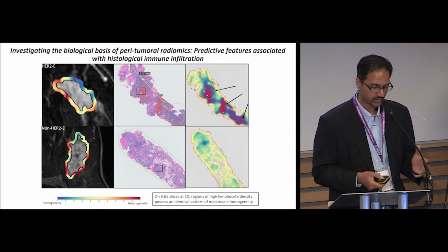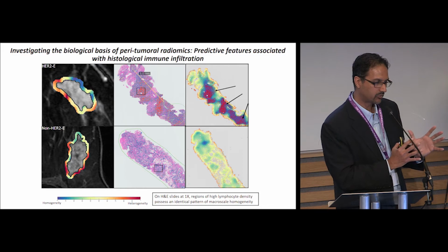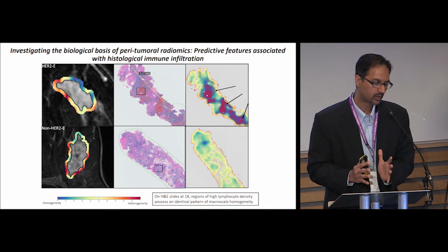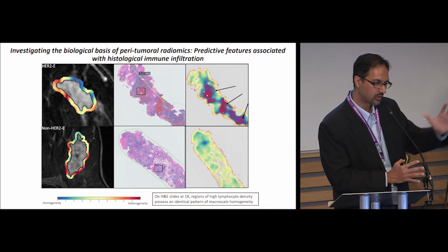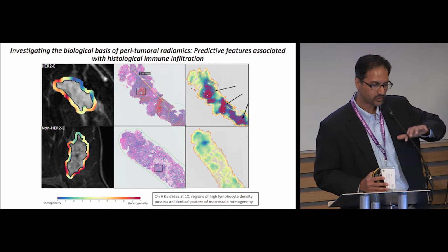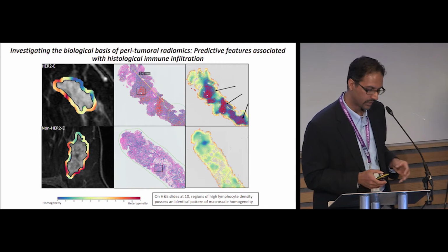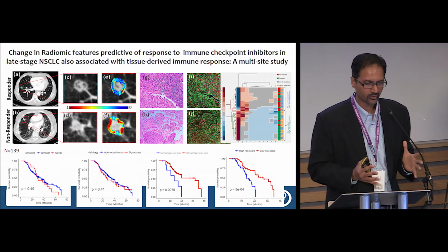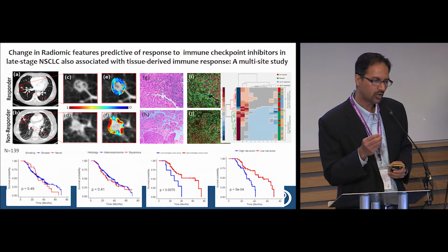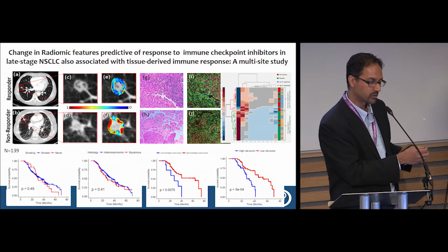Well, in a subsequent study that should be online next week in JAMA Network, we found that the patterns on MRI that came from outside the tumor were the way they were because of the spatial arrangement of TILs from peritumoral biopsies obtained from that location. So essentially, the spatial arrangement of the TILs was driving the radiomic or texture patterns outside the tumor. And so this is another role for digital pathology, where it can provide a context, a morphologic basis to explain AI or radiomic features from radiographic imaging.